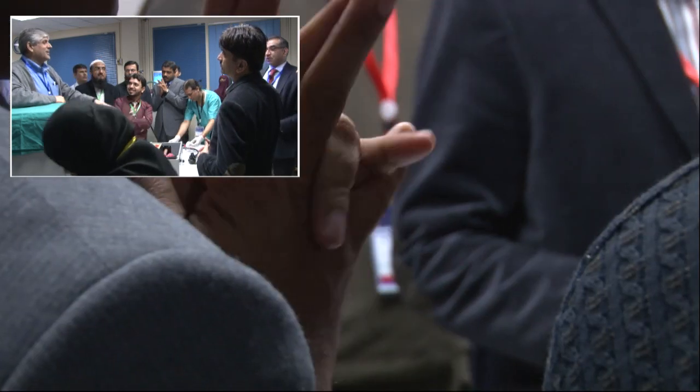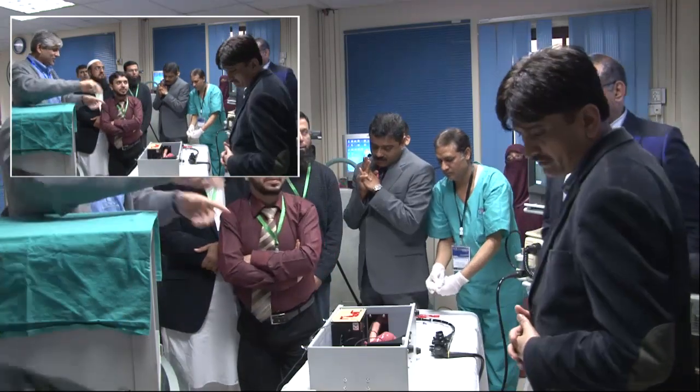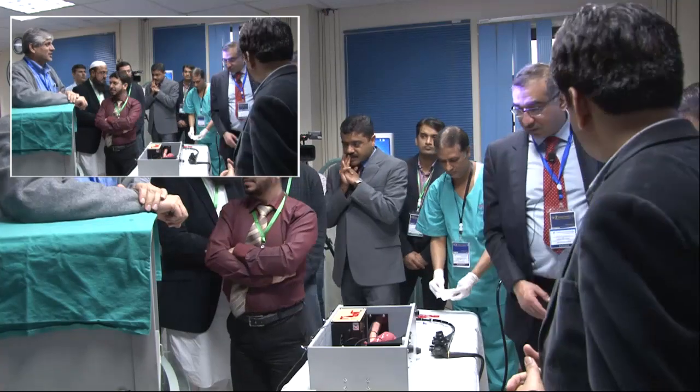But I think I still find a lot of my trainees, in spite of the fact they've done quite a lot, they end up in the fundus. That's why I was saying that when we go to the live cases, it will be much better to show. Exactly. You can show this. It's a bit difficult one.